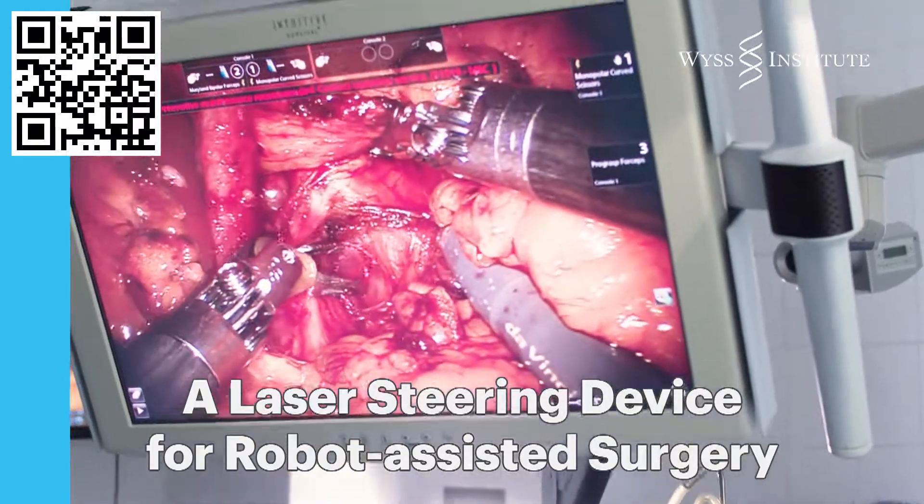This is a project on a laser steering device for robot-assisted surgery. This has spurned some innovation in recent years on the surgical side of things in minimally invasive surgery.